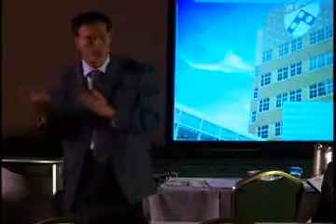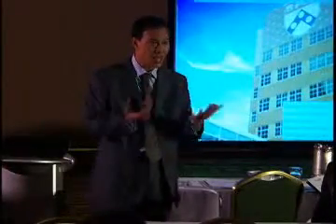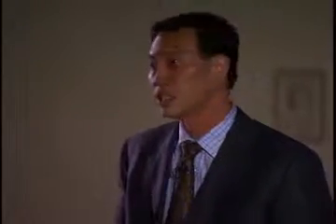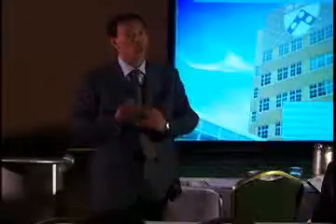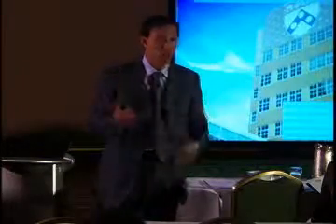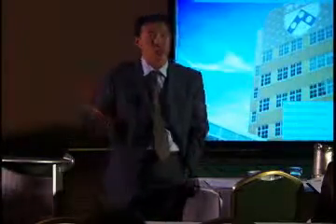So yes, there are a lot of situations whereby a surgical plan is then taken to the OR and executed. Of course, if you've got a standard acoustic neuroma, you don't really need a surgical plan from a neurosurgeon's perspective because you're going to do it in one of the three standard ways. But there are situations where it would be useful for us, and one of the other examples is a glioma with an eloquent cortex, where you want to look at the DTI and functional image, and you can input that in, and that again can allow you to plan that operation.